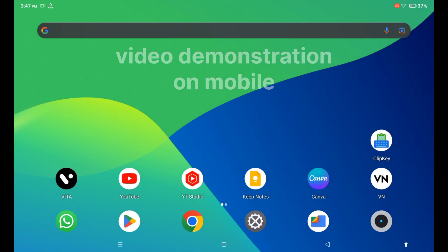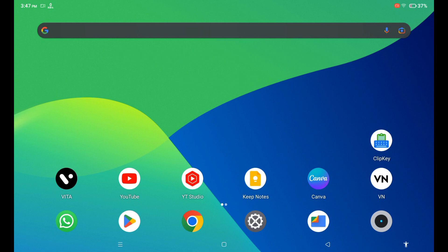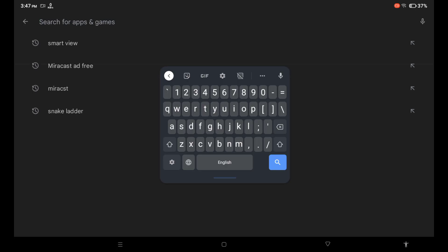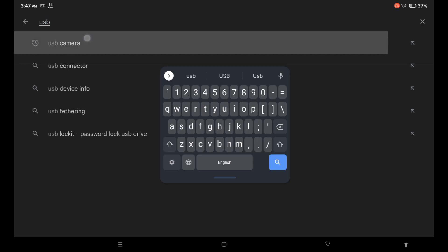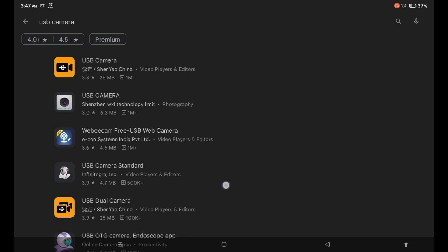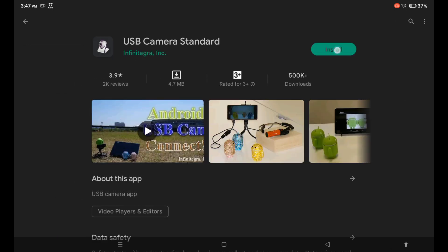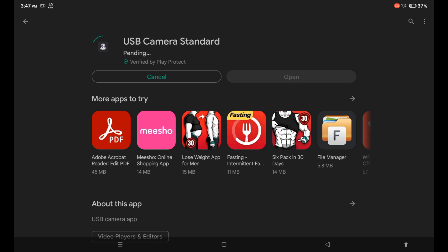Coming back to our topic, the second point is software details and its installation. First I will show you how to install the Android application on your mobile for using the intraoral camera. You need to go to the Play Store on your mobile or tablet and search 'USB camera'. There will be many options, but you need to choose 'USB Camera Standard' and install it. Once it gets installed, we are ready with our software.